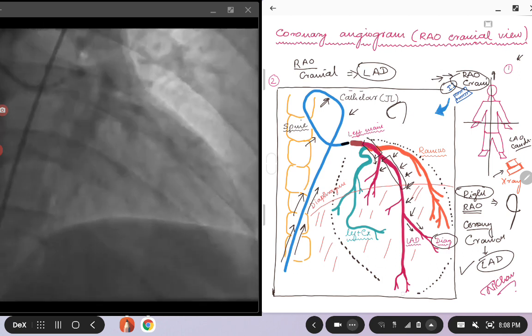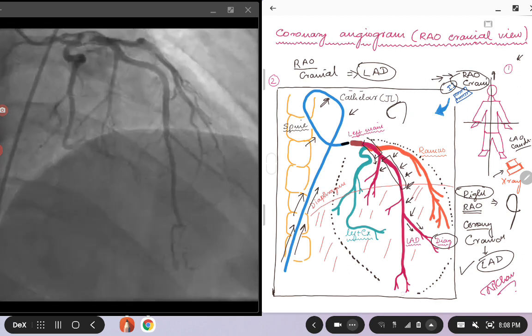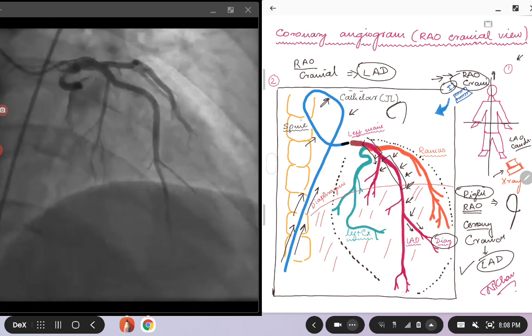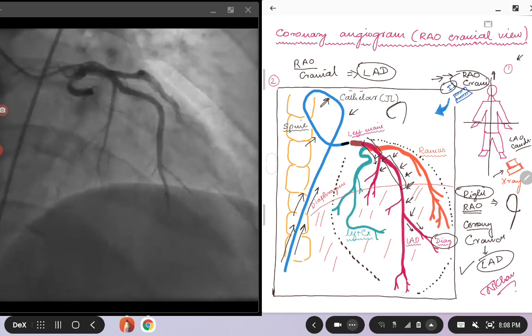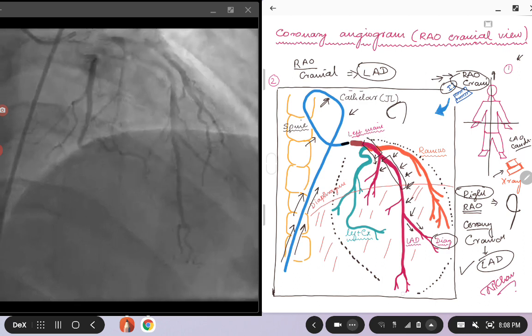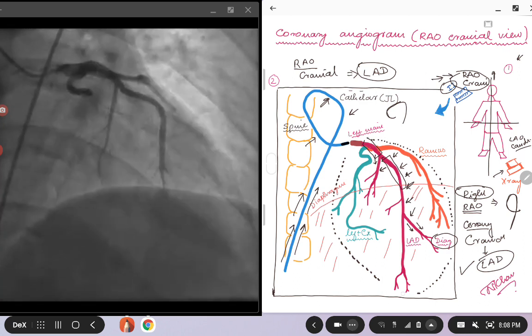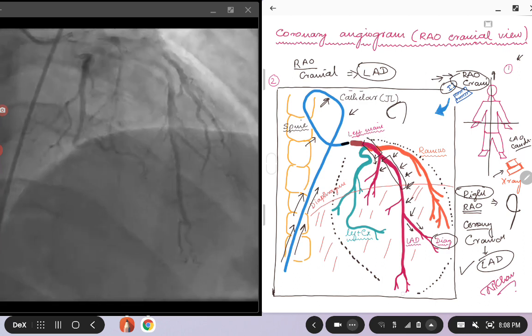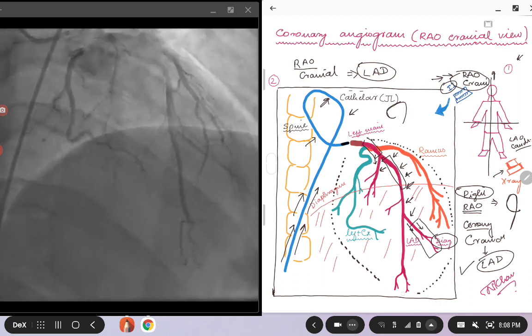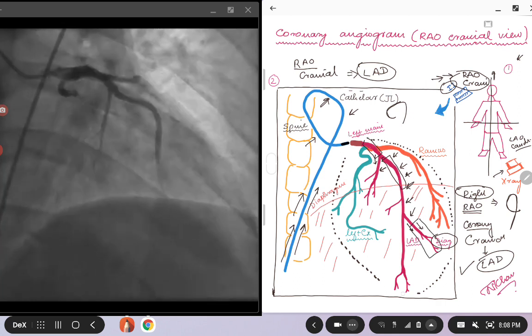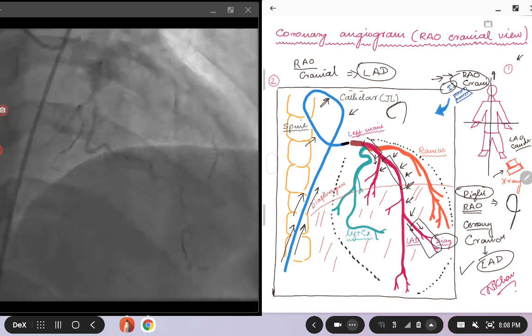This is the same patient that we discussed in the LAO caudal view and the RAO caudal view. If you go back and look at those cine images, you will see that you will not be able to look or appreciate the diagonal branch coming off from the LAD. But in this view, you can see it very nicely and you can see if there is any stenosis or any disease in that diagonal branch.